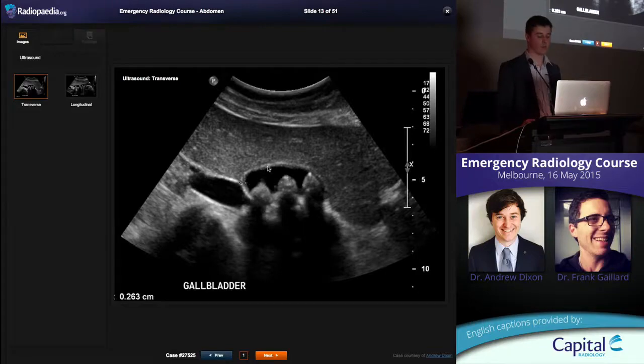Here, the wall of the gallbladder you can assess really, really well because there's bile inside it, okay, so nice anechoic bile, and then you get a nice thin wall and then the liver sitting next to it. The liver helps, it gives you a nice window to look at the gallbladder. This is not the greatest spot to measure the wall of a gallbladder. You should always measure things perpendicular to the way in which the sound waves are arriving. You can get a little bit of variability out here. So you probably should be measuring wall thickness directly in line with the transducer.